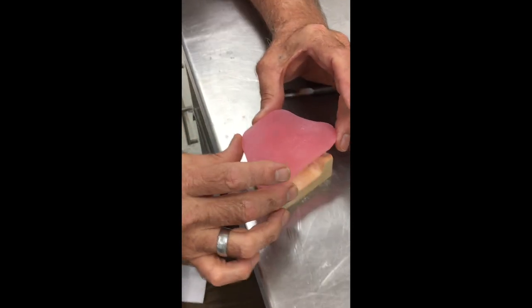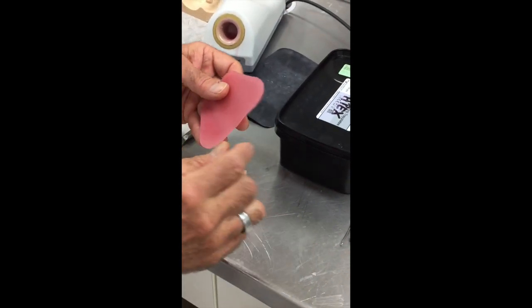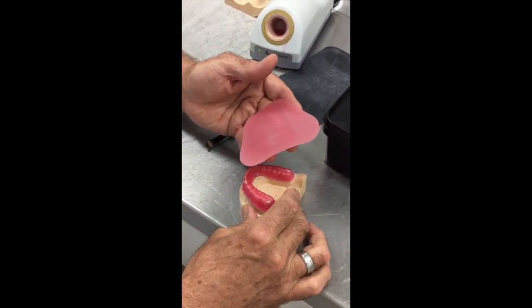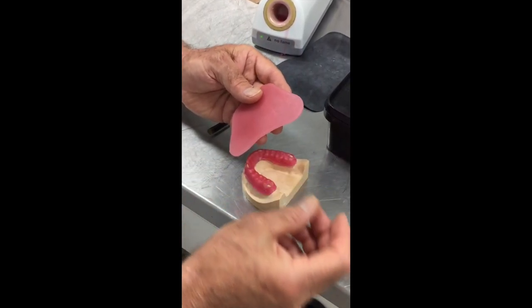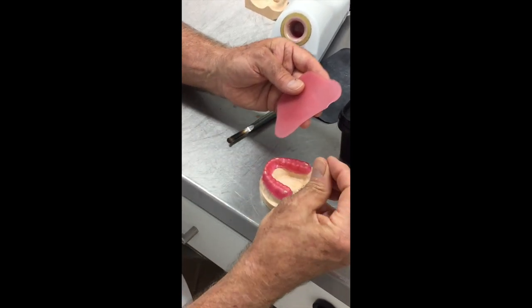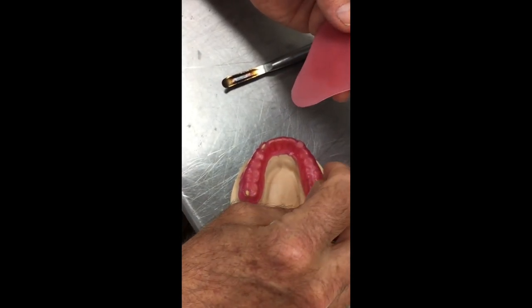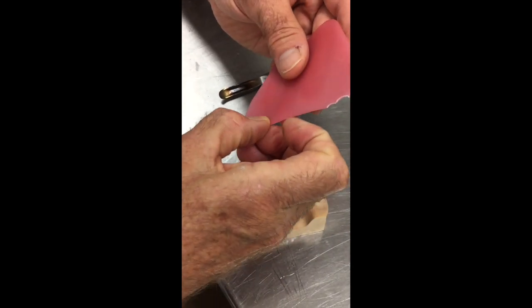I actually like to buy the upper blanks only, not the lower, for this purpose, because we can use the bit that we cut out for our handle, and we can get a nice solid handle while adapting our tray. With some of the lower blanks, you don't quite get enough material to make the handle as well, and you're using more than one blank. So the first thing that I'm going to do is just take a small amount of this and place it into each of these tissue stops. Just enough to fill those up. If we just take it off the corner here, we're going to fill those tissue stops up.